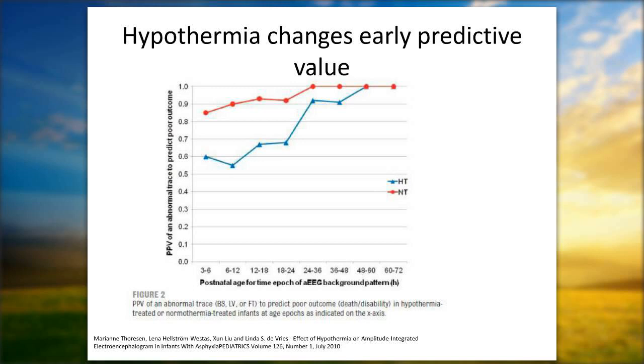For our cooling babies, the predictive value is not there until we get past 36 hours. So again, we need to wait all the way, and really that 48 hours is where we match back up to that full predictive value.